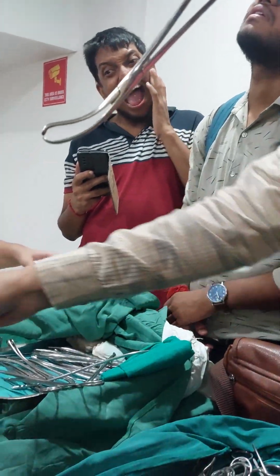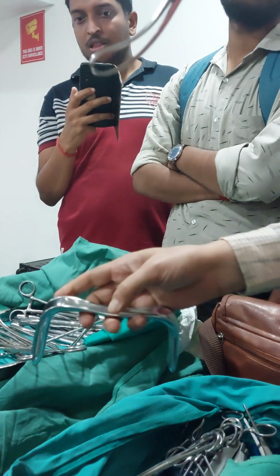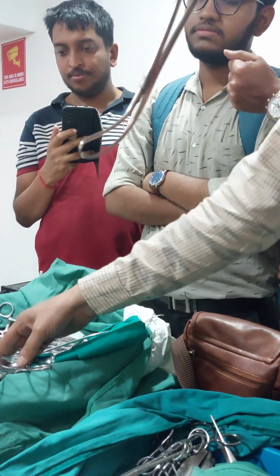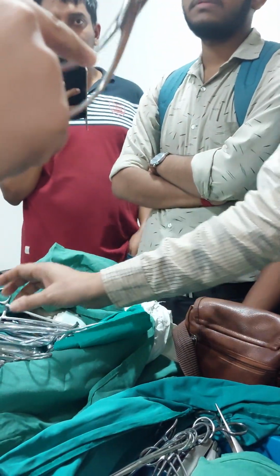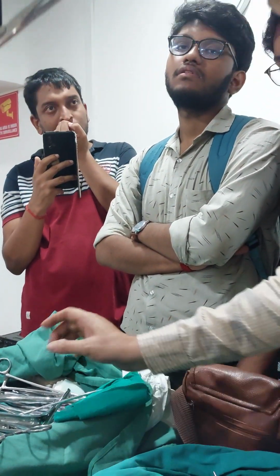Some assistant has to be there to hold this thing. Okay? You have to hold the anterior lip of the cervix. The anterior lip of the cervix you are holding like that.